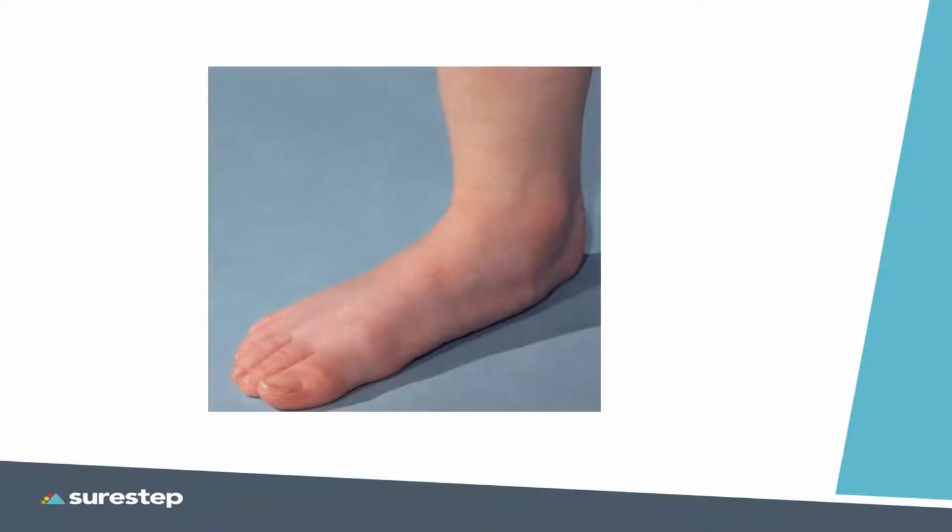When we look at this foot, we realize that it's a severely pronated foot. The problem with it is that we generally want to push up on the arch and make the foot look right. The reality is the pronation is more than this. It's more than a one-dimensional deformity. It is, in fact, a triplanar deformity. What we have here is not a problem with the arch. The problem stems back to the calcaneus. If we could bring the calcaneus back to a vertical position, you would see the arch also come back into place.